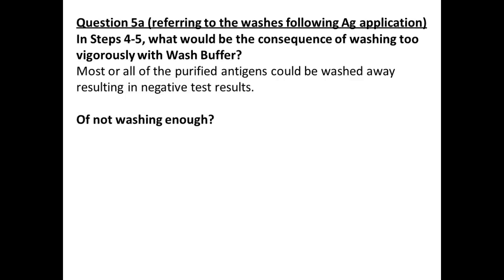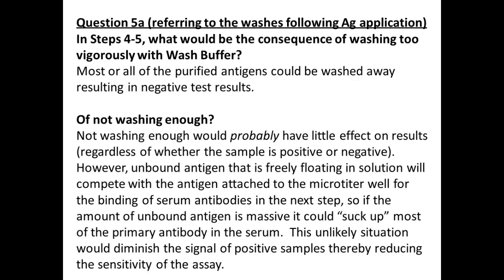What if you don't wash enough? You're going to get antigens that are bound and antigens that are not bound in this case, right? And what's going to happen when you add the antibodies? They're going to bind to the ones that are bound and the ones that are not bound. The problem is the ones that aren't bound, what's going to happen to them when we wash? They'll get washed away. And also you have this competition now, right? Between the ones that are bound and not bound. We don't want that. We only want them sticking to the ones that are bound so that they will stay, right, in that tube. Make sense? Okay. So that's that in a whole lot of words.